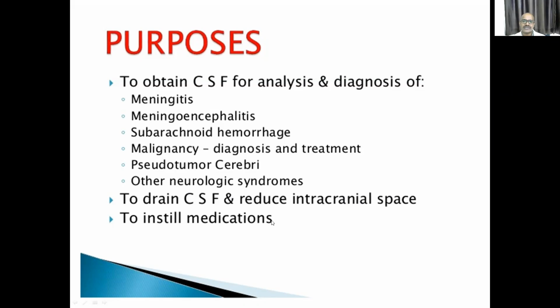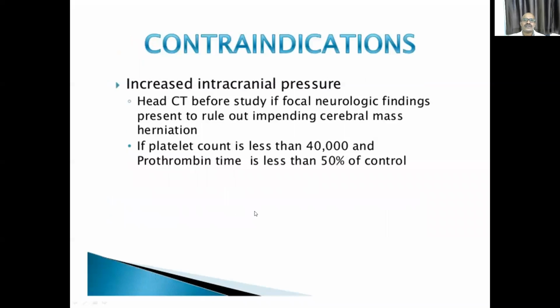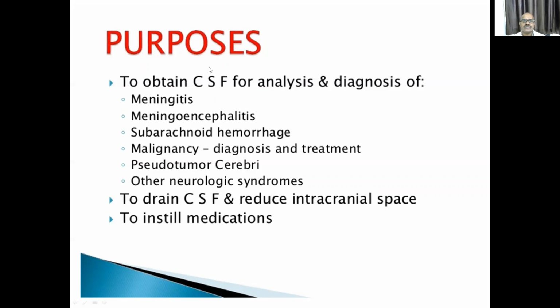Also, for anesthesia, medications are given with the help of the lumbar puncture needle. So this is the purpose of the use of the lumbar puncture needle. So what is the procedure?